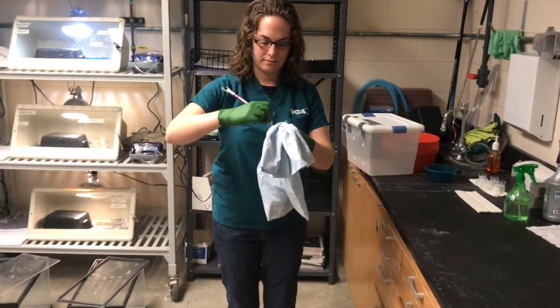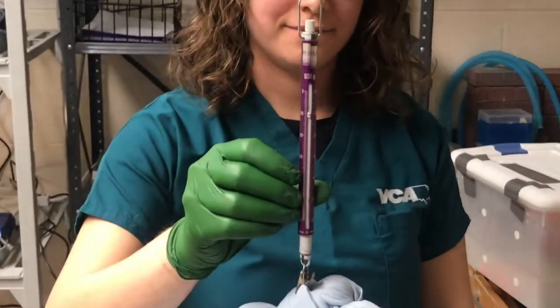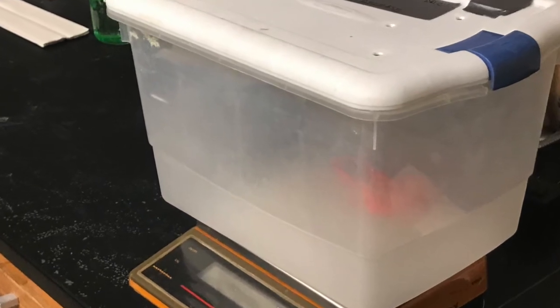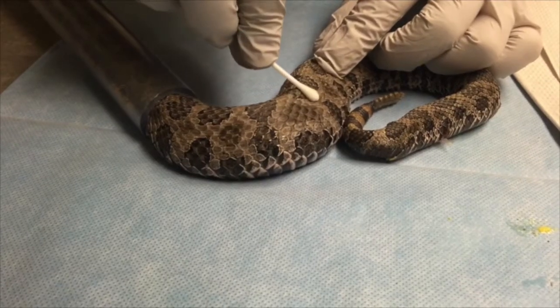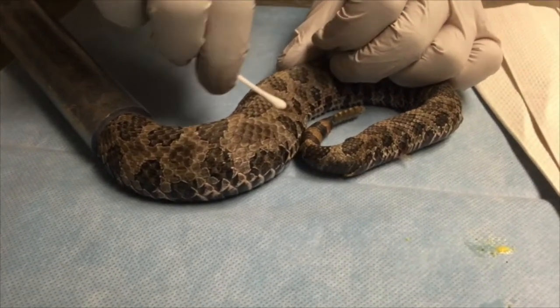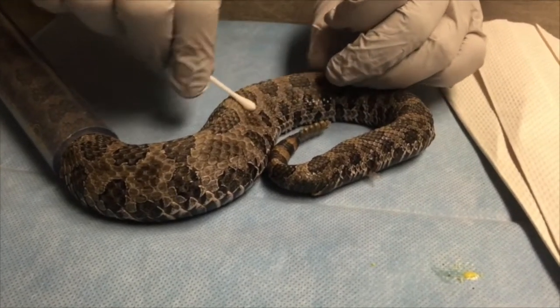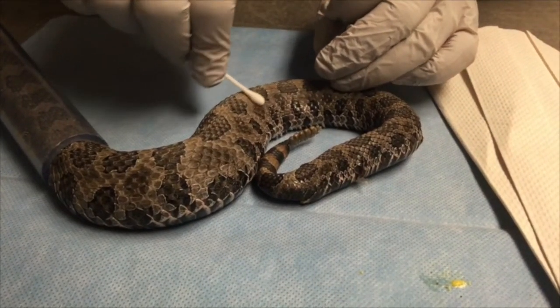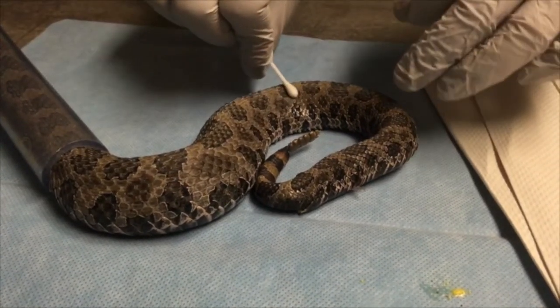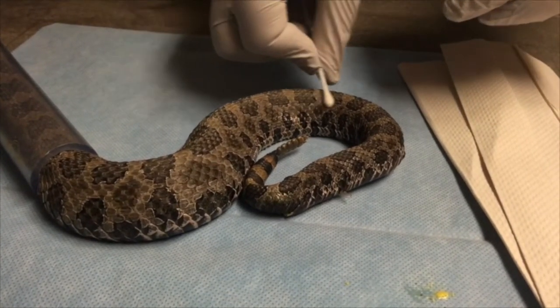Each snake should be weighed either in a pillowcase using a spring scale, as demonstrated here, or by placing the snake in a clean container on a digital scale. Use the provided cotton tip applicators to collect samples from the snake. For snakes without lesions, 2 swabs of the entire body will be taken. Take a clean swab and pass it up and down the snake's body 8 times, pressing firmly but gently with the side of the swab and turning the swab as you go. Make sure to sample the sides and dorsal body of the snake. Do this twice for each snake.